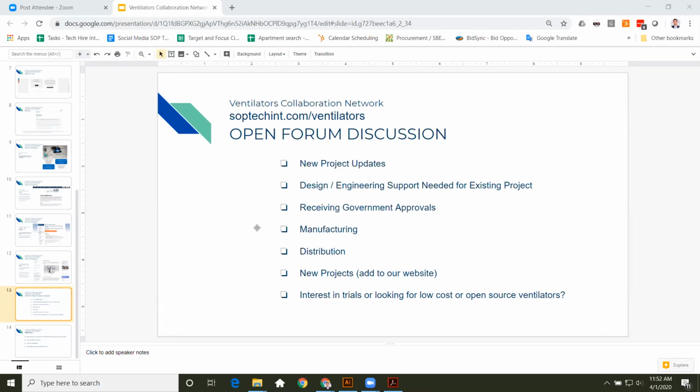I'd like to comment on that. I think it's pretty critical to have those designs up, because that's a prototype design, but to turn it into a manufacturable design, you really need to have the input of the people who are going to be the manufacturers based on what is more manufacturable, and they have the expertise to basically contribute to the designer if he or she doesn't have that expertise. Because at the end of the day, it has to be manufacturable in a reliable manner.